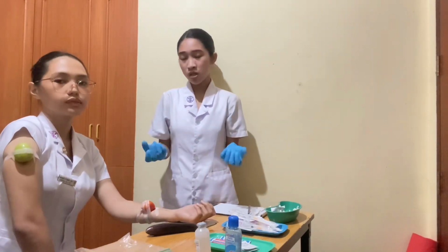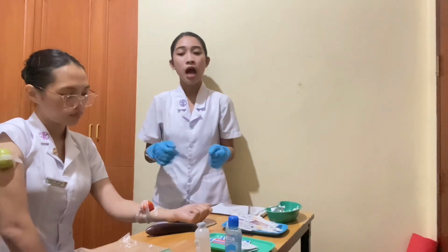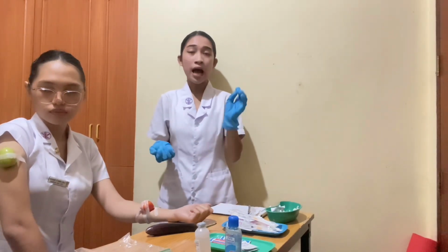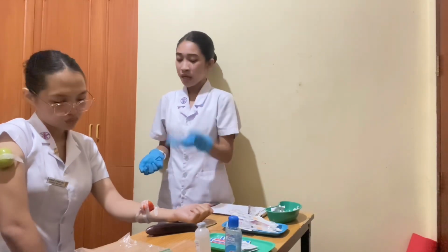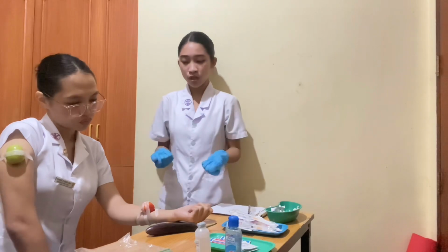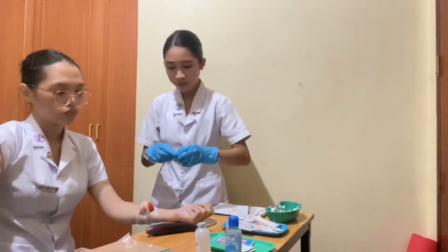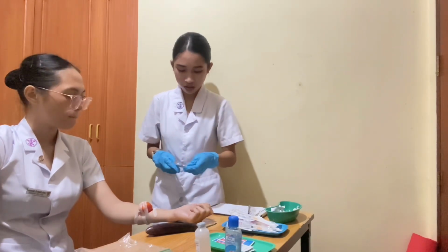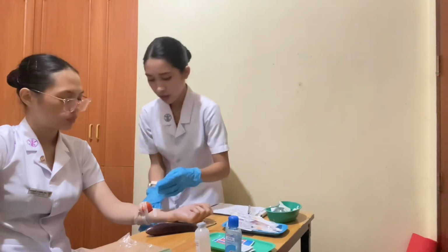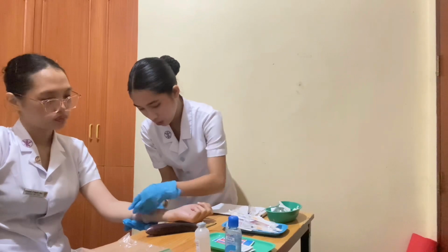So now that I am done wearing the working gloves, or the clean gloves, I'm going to get an alcohol pad and cleanse the site of my patient in a circular motion to reduce the risk of bacteria. Okay, ma'am, I'm just going to clean the area. Okay. There are no signs of lesions in the area, so I'm just going to use that. Okay, ma'am? Just relax, ma'am, and after this, we'll be done.